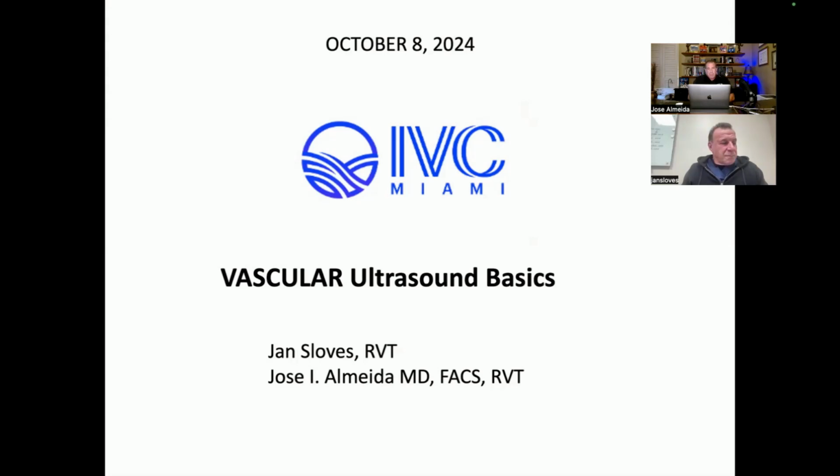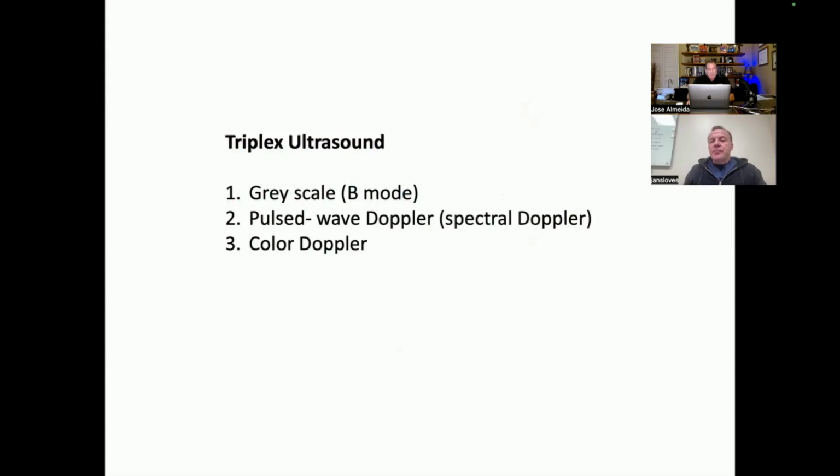And what we thought we would do is cover some of the common questions that people would ask. These are physicians that scan, mid-levels, physician's assistants, ultrasound techs, all kinds of backgrounds. They're learning how to scan a patient, holding the probe in their hands with live patients. So we're going to start with the basics. I'll hand it over to Jan here.